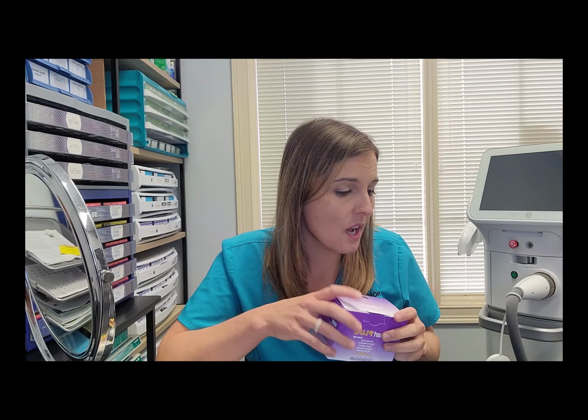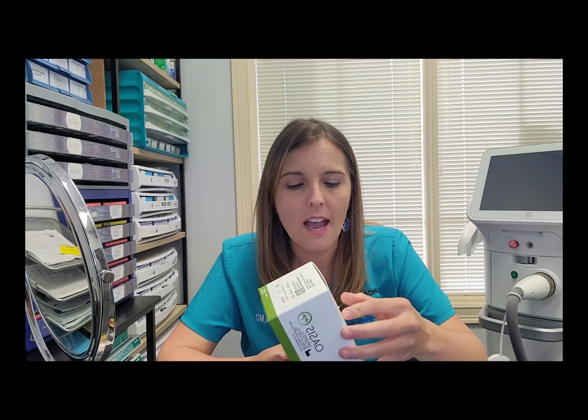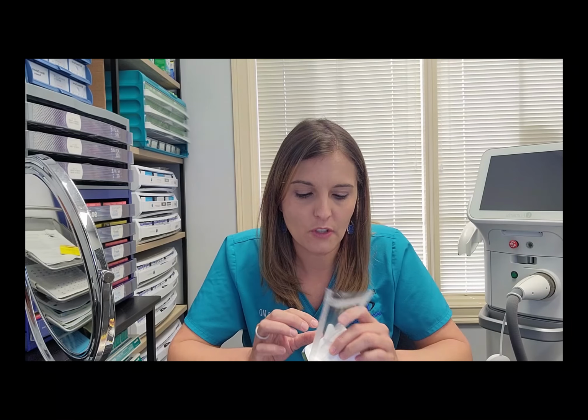Once I've made that opening a little bigger, I can slide in the plug. I have several different brands of plugs. I have temporary plugs, I have permanent plugs, I have other brands of permanent plugs, just depending on the patient need. I usually like to do a temporary plug first because I want to make sure it's not going to cause any problems. Some people's eyes will water when they have dry eyes, so if I put a permanent plug in and it turns out that they water too much and they don't like it, it's harder to get out, versus a temporary plug will dissolve and go away and take care of itself over time.